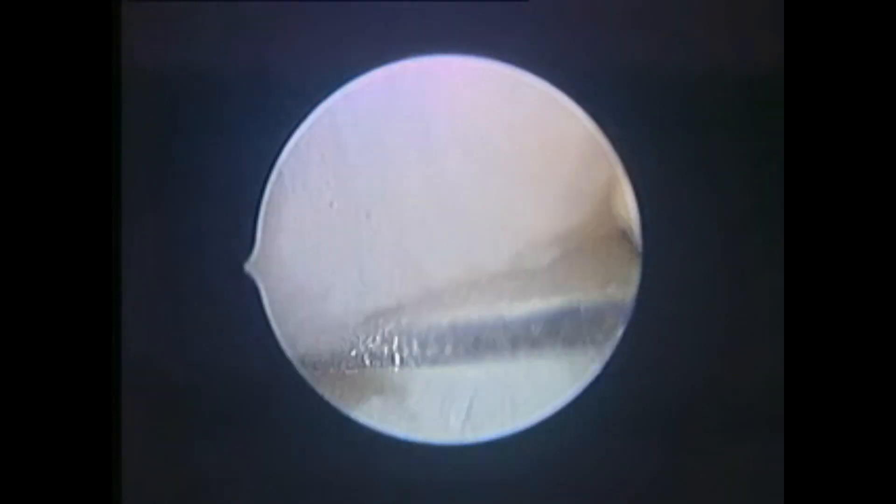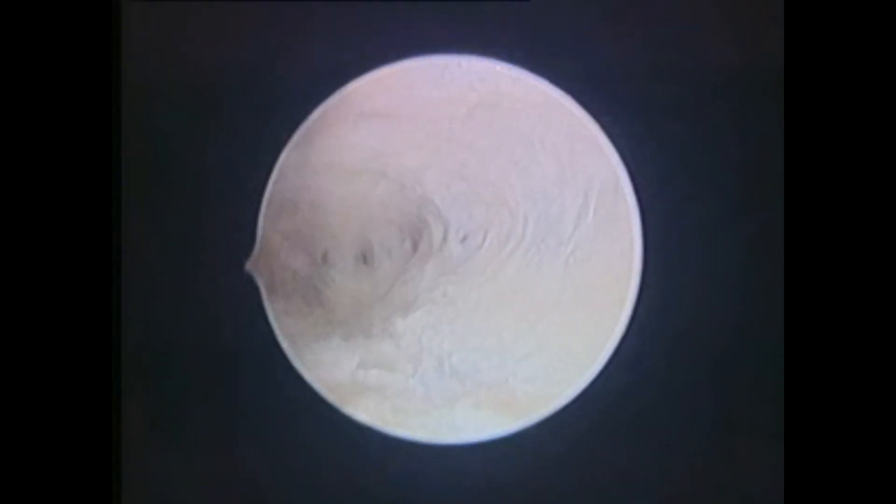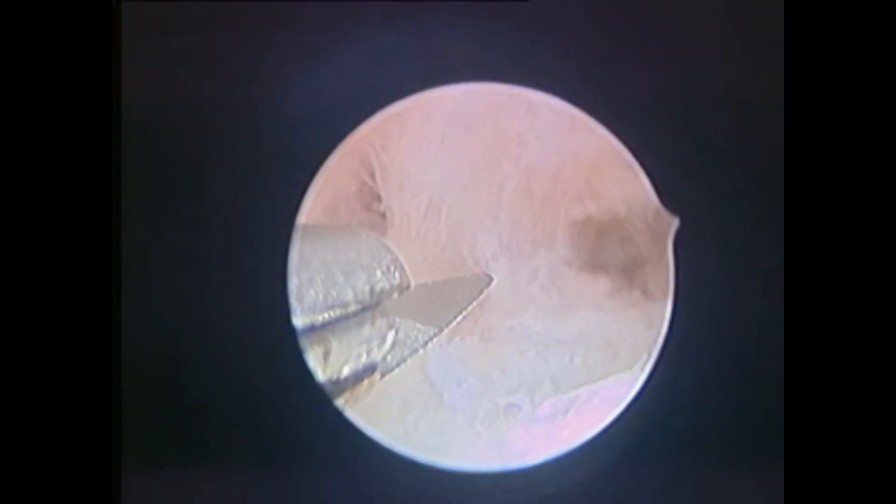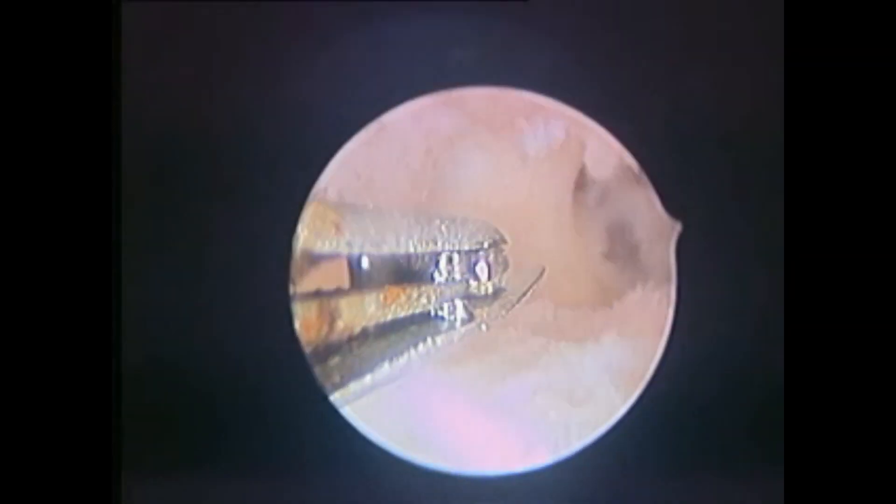It is always better to withdraw and make sure you are in the cavity before doing adhesiolysis. Do not cut if you can't see anything. If you see pink tissue, that means it is not endometrial adhesions but myometrium — don't cut, otherwise it will cause perforation. You can see adhesions in the cavity, everywhere. In the mid-cavity, as I'm cutting, you can see the adhesions and a little part of normal endometrium. Continuing adhesiolysis on the right lateral wall — when you cut, the cavity opens up.